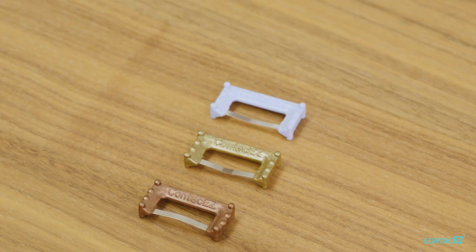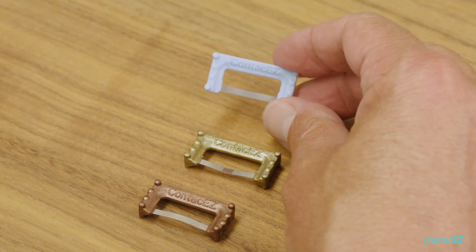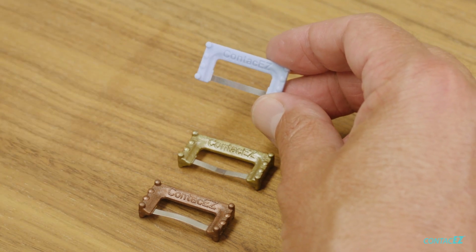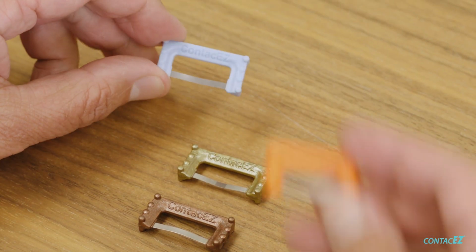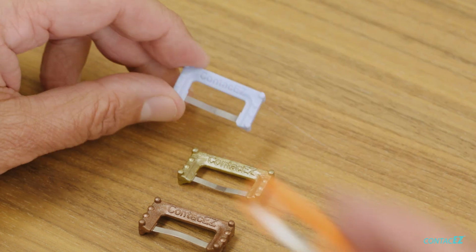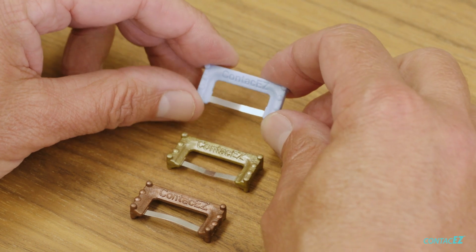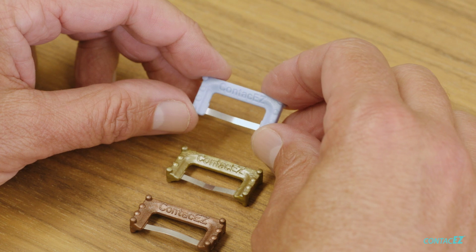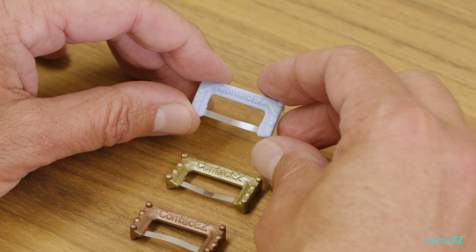So these are the 3 strips in the subgingival strip system, and you can see they're all narrow strips. And when I say narrow, again, I mean in terms of vertical height. So you can see they're shorter, if you will, or we call it narrower than, for example, one of the regular strips. And that's because these are all designed to go subgingival and do work beneath the contact. And so we don't want to go too deep and we don't really want to affect the contact. We're looking to get rid of basically overhangs here, and maybe changing the contour.